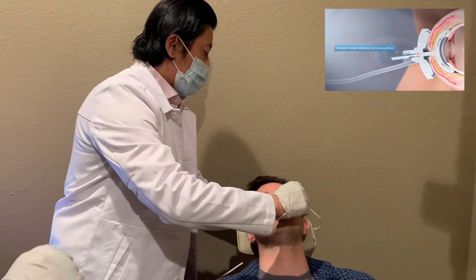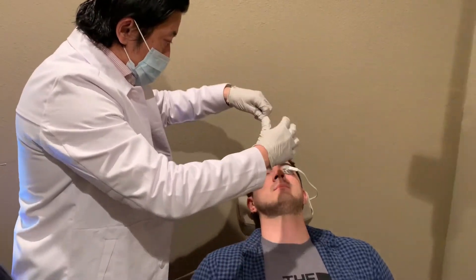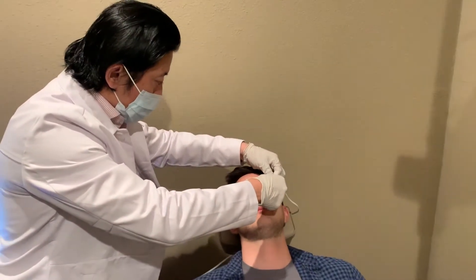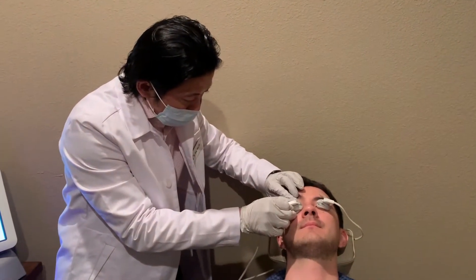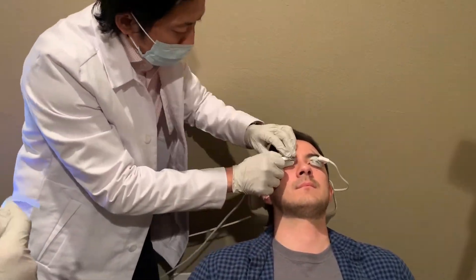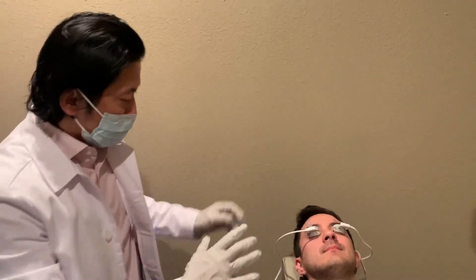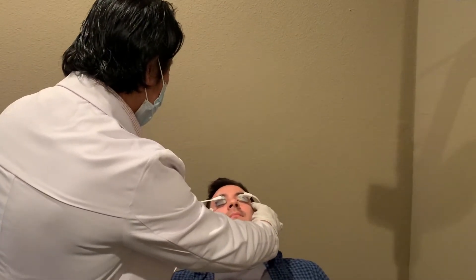Now go ahead and close your eyes — that kind of holds it in place. And same thing, go ahead and look down. Nice and secure and balanced and even there. So we should get pretty good treatment there.